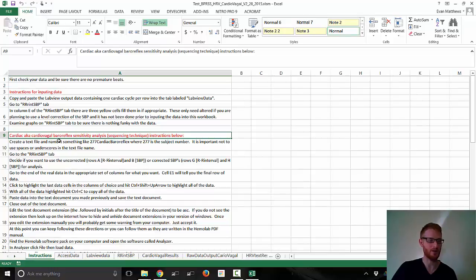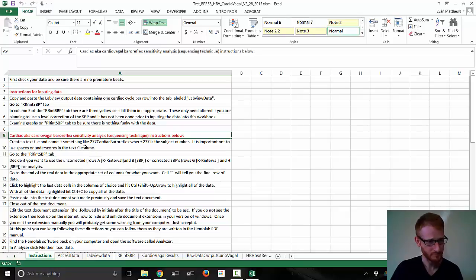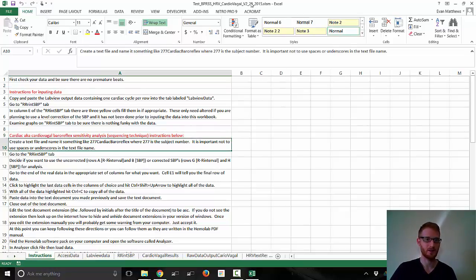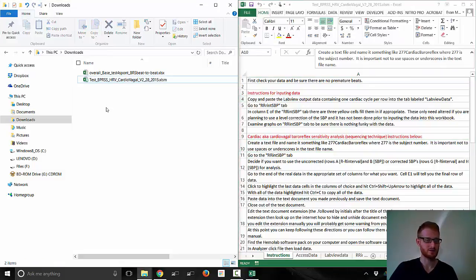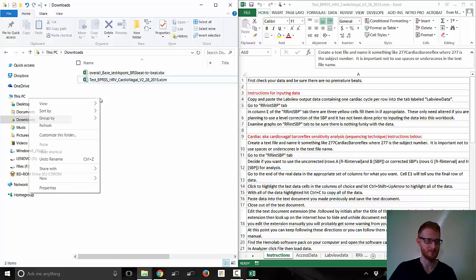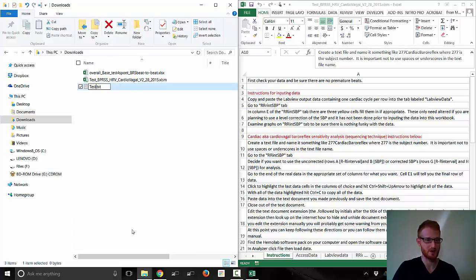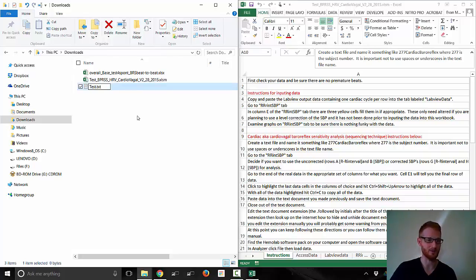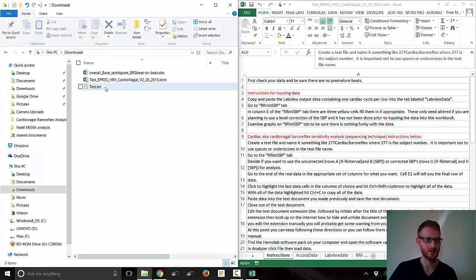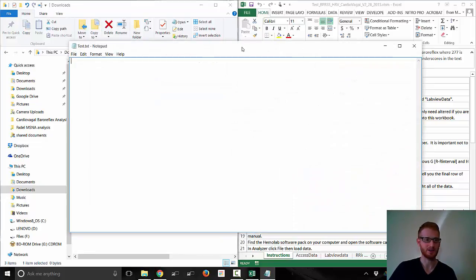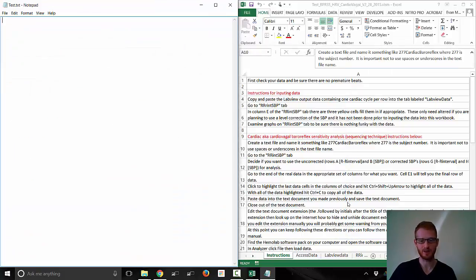So let's go and do the actual cardiac baroreflex sensitivity analysis. With this, you need to make a text file. Here's whatever folder we're saving our data in — this is the template right here. So let's just make a text file: right-click, go down to New, and click Text File. We'll write 'test', but normally you would put your participant's ID number there to keep track of things. Let's open this text file up — it's just a blank text file.